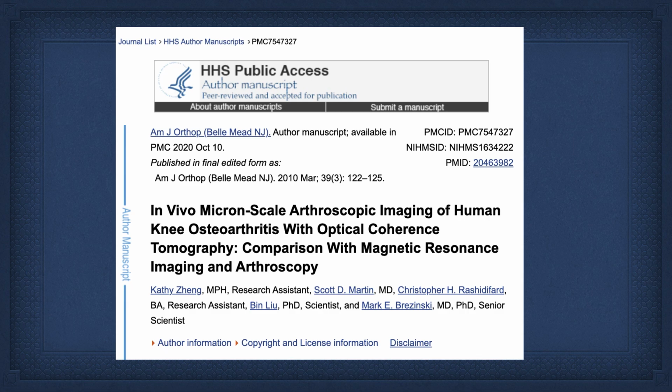The ones with normal PS-OCT at time zero developed no osteoarthritis. And so we need to publish this data. And I want to emphasize it's a small study. It was only designed as a feasibility study to design a probe. So again, we weren't actually going after those results with the study.